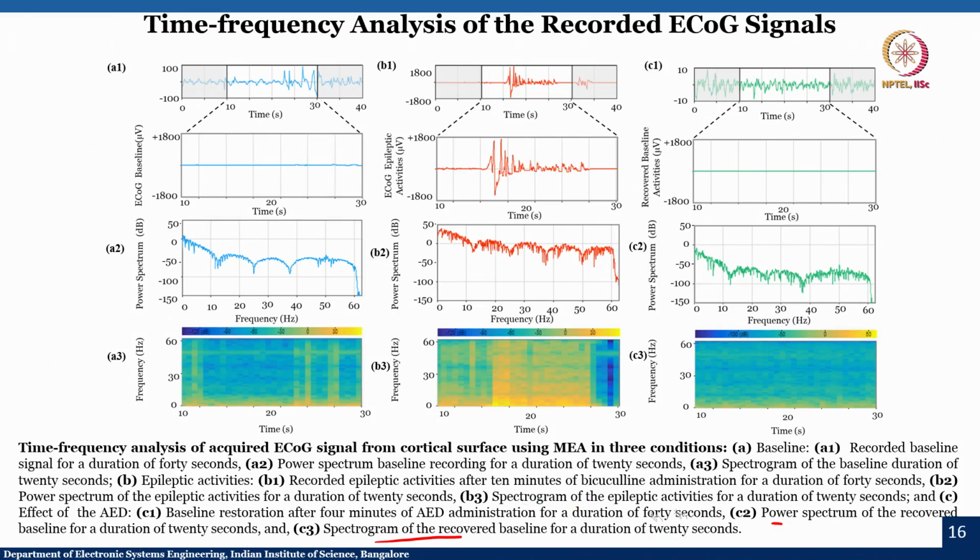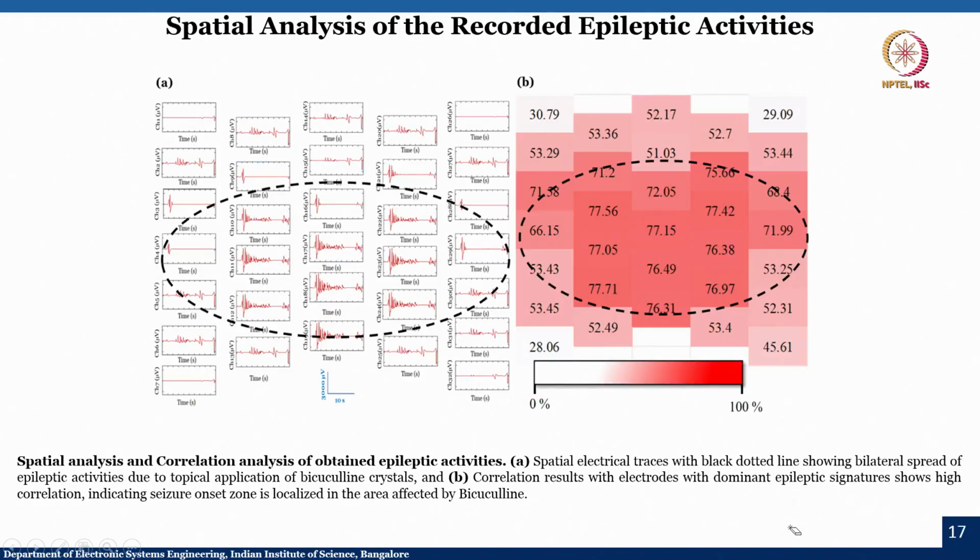In the next class, we will see how to take it further, okay. But let us complete here. Since we have observed this, from it can you at least say where the maximum number of epileptic episodes is? We may not be able to do source localization here, and may not be able to tell you exactly where things are happening, but from here at least we can say that this is the region in the brain where the epileptic episode has occurred compared to the other regions of the brain.